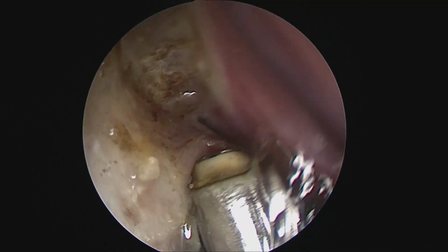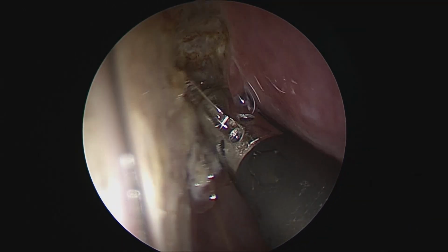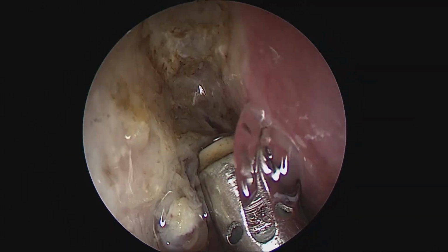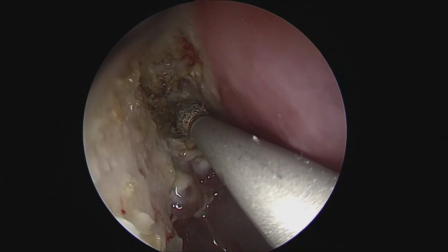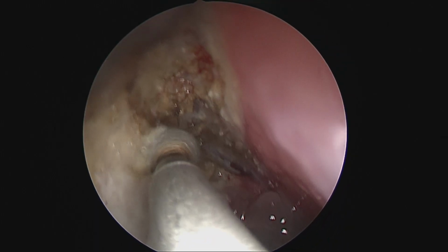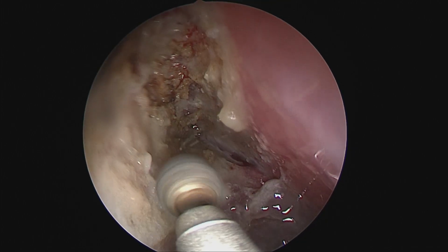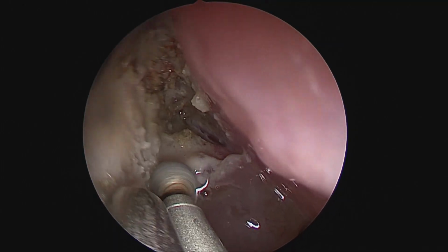Our attempt would be to take off this lesion in an en bloc fashion, though in case we are unable to do so, to find the site of attachment we might remove it in a progressive piecemeal fashion, or something called a multi-block progressive resection. So once we have defined our boundaries on the right side nasal cavity, we can already see the floor of the orbit and the medial maxillectomy cavity.